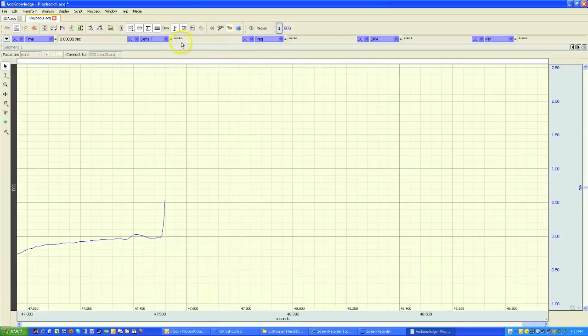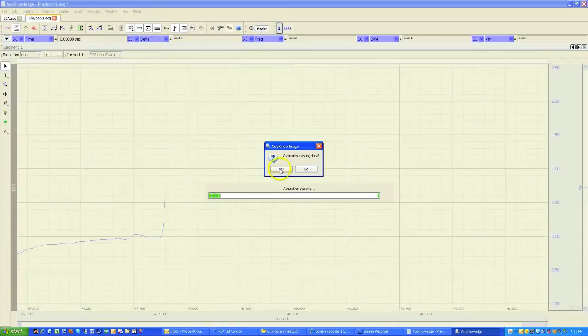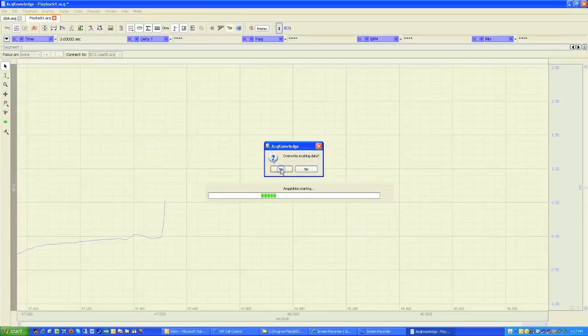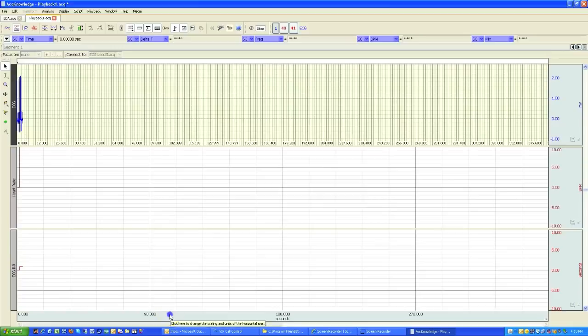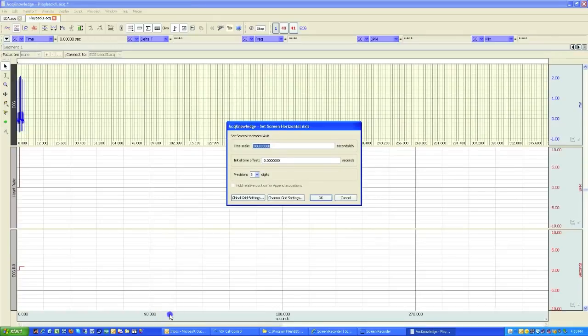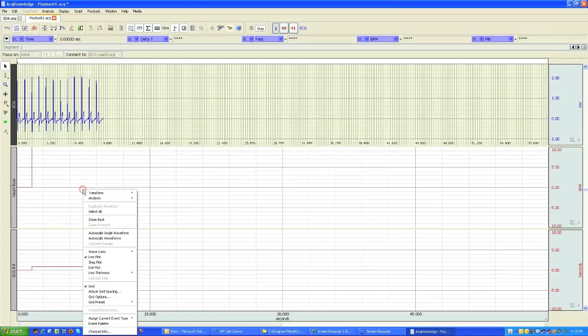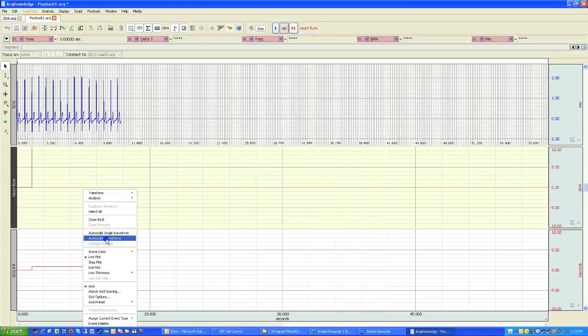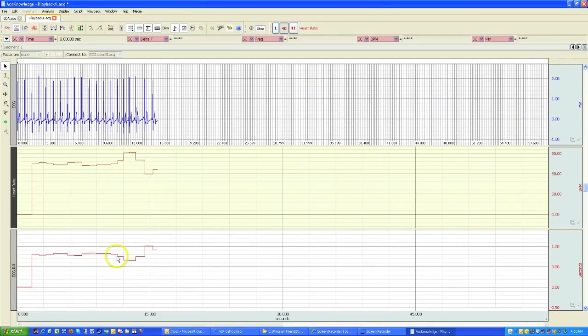And now when we hit the replay button, it asks me if I'm going to overwrite. I don't mind. Hit OK. Now I've added in these two channels. And if I expand this out and I'll auto scale, we've got heart rate and R to R interval.